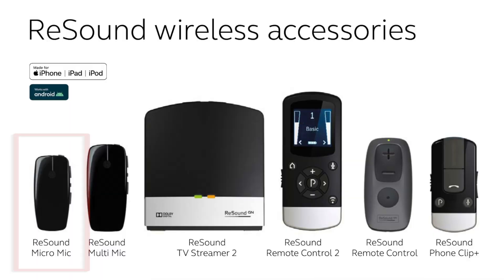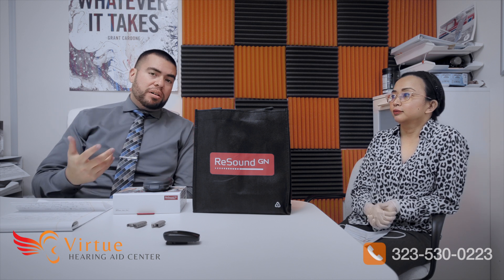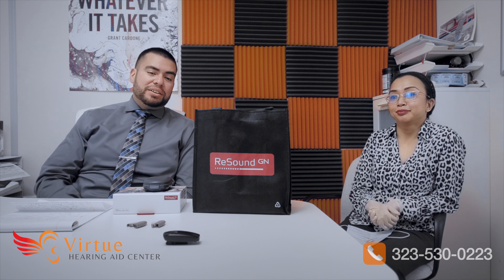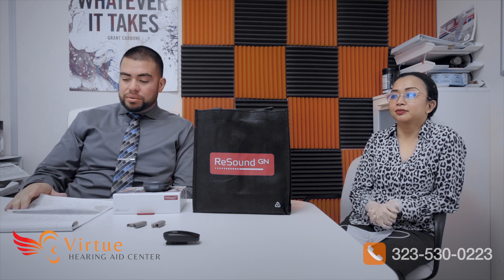We also have the micro mic, which is a smaller version of the multi mic. It's mostly just the microphone function — no extra features — but it's more discreet. If you don't want to use the bigger multi mic, you can opt for the micro mic. It's small, light, and you can have it in your pocket or clip it to your shirt.